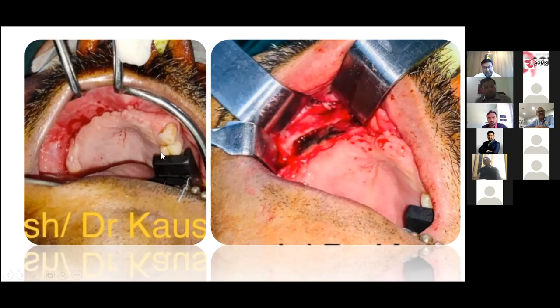So, is it wise to put an angulated implant using the bone above the roots of the teeth? Or is it wise to just sacrifice only one tooth, like the canine, and put an implant over here? Because if you are using an angulated implant above the roots of the natural teeth, what about the future when the patient requires any kind of implants, when he will be missing or requiring a replacement of any of these teeth? Because we have already used that bone.